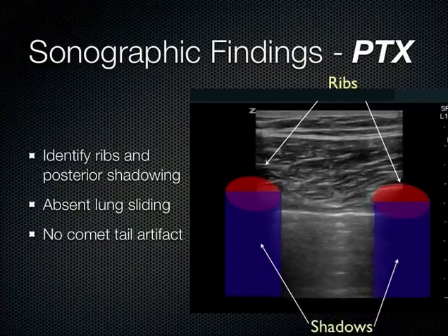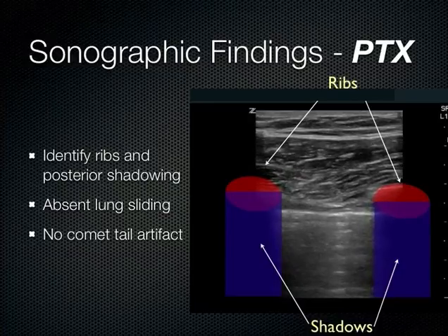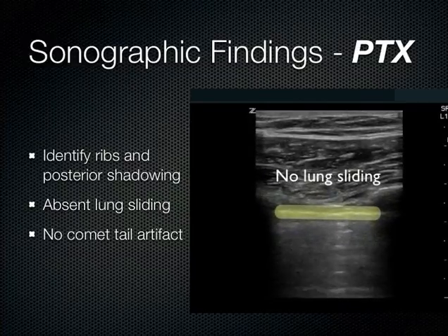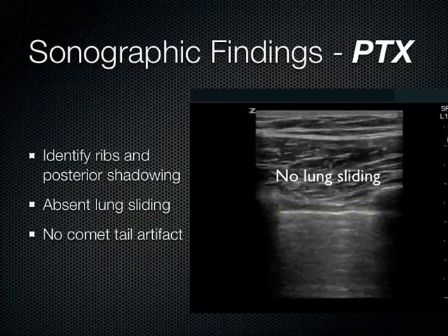Okay? All right. Moving on. Just a couple examples. Is this lung sliding? So, pneumothorax or not? No. No? Good. You're experts now. That's really all you need to know.